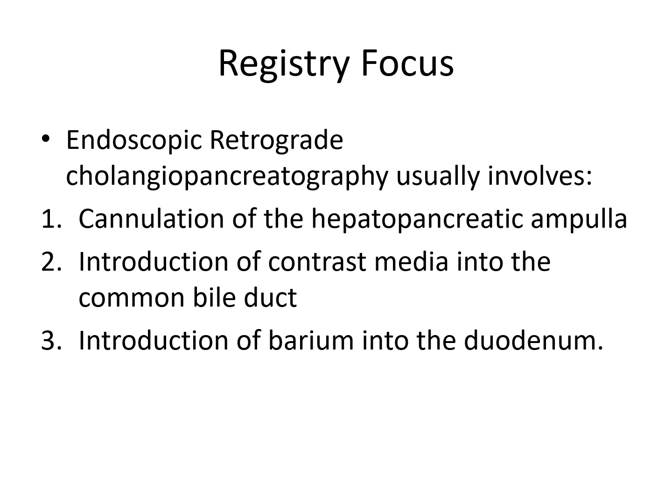Okay. Registry focus, you are going to need to know what ERCP stands for. You're going to need to know how a procedure is performed, and what happens during that procedure. Okay. So, of these three choices, which are correct?